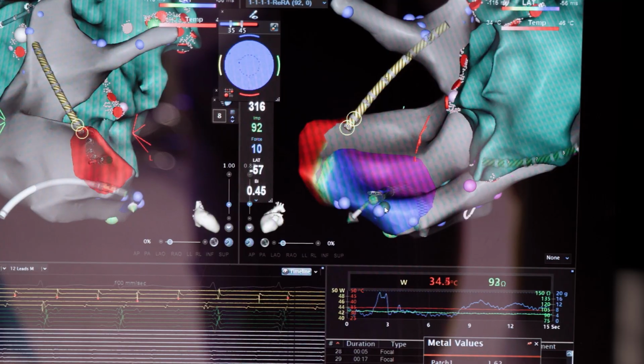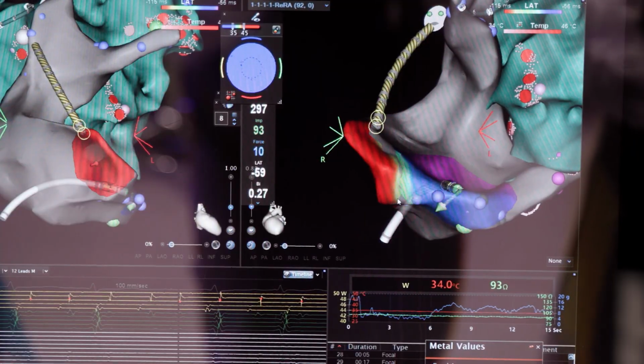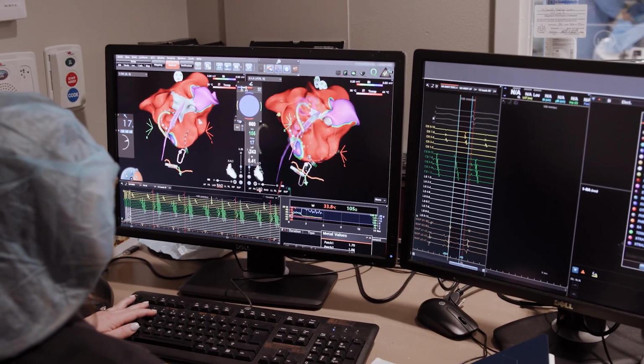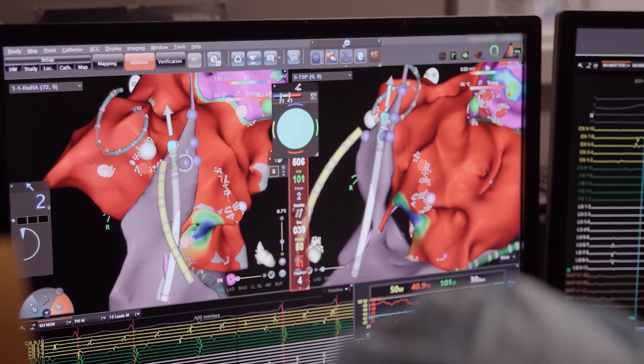So for example, if there is a focal arrhythmia, when the arrhythmia stops, we actually can tag the location and ablate around to make sure we consolidate the effect, which would not be possible with that degree of accuracy without the three-dimensional mapping system. So it clearly is a critical part of the ablation procedure we do today to have the support of the three-dimensional mapping system with the catheter.